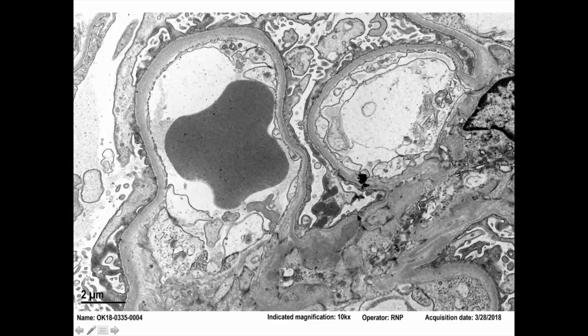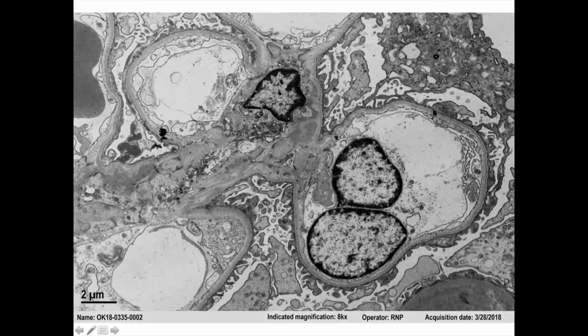And we do have electron dense deposits over here. تشوفونهم? We have electron dense deposits over here. So we have mesangial deposits in this case. Okay, نرجع مرة ثانية. أكيها هذه اللوب of the glomerulus, أكوهم البودوسايتس. We do not have any electron dense deposits تحت البودوسايتس, لأن لو إنهم تحت بيكون سب إبيثيليال, لا ما عندنا. ما عندنا أي شيء تحت الإندوثيليال سيلز, لأن إذا كانوا بيكونون سب إندوثيليال.